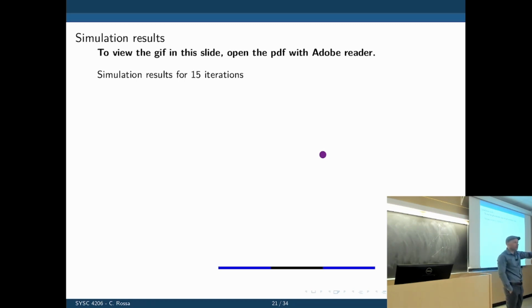You see the difference? So in the previous slide, when we were doing the algorithm, the robot's just stationary and then it will move after the algorithm. Yes. So this is happening offline. You're not touching the robot. You're running this several times, and when you're satisfied with the solution, then you go to the robot and make it move. This is for 15 iterations, and you will see later it oscillating around the position and then eventually settling.